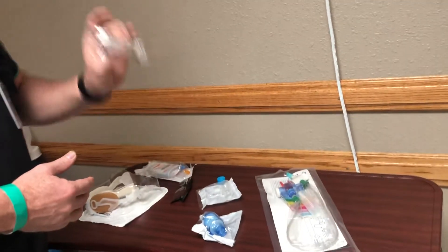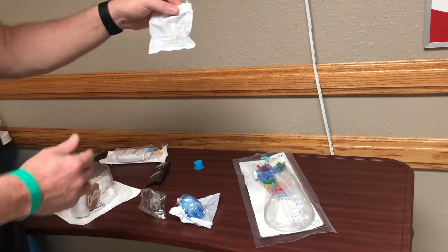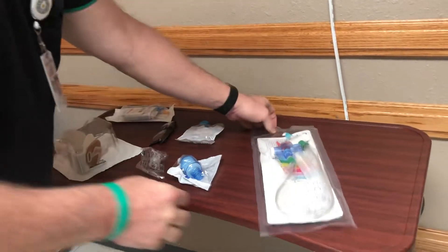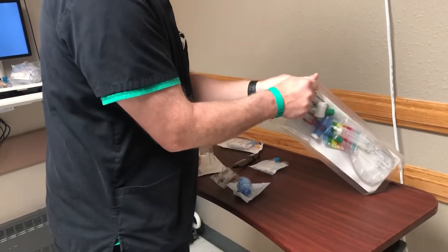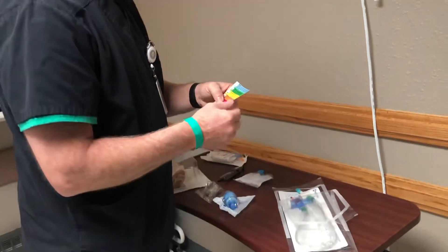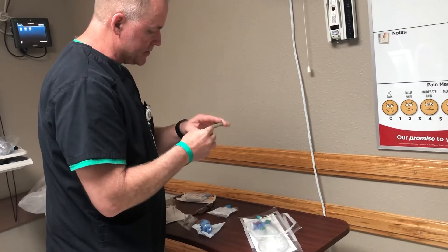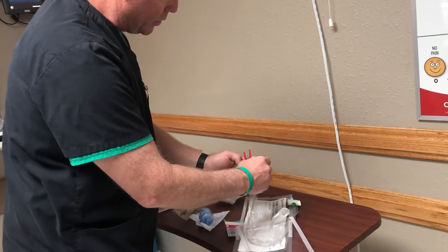Now for setting up the patient circuit, we have the in-line suction, the HME, and what we call the CO2 cubet so that end-tidal CO2 can be monitored. We also have the ET tube holder and the MDI adapter. The in-line suction is a 72-hour change-out. We'll open it up, pick a day — say today is Monday — we'll change it out on Thursday. Take a tab off and wrap it around the suction to mark what day we need to change it.